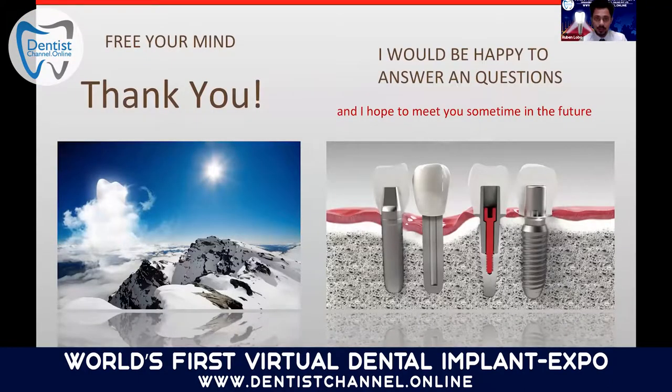All right, the first question is, can the micro gaps be overcome by placing calcium hydroxide paste on final placement of prosthesis? Not long term, no. I think there are a lot of possibilities of putting something into the implant connection to avoid bacteria, but we're talking here about implants as a lifetime restoration for the patient. I think it's not anymore today that an implant should last 10, 15 years. And if implants today are lasting 20, 30, even longer years, then I think the connection needs to be a bacterial seal connection as a conical connection and not with an additive.